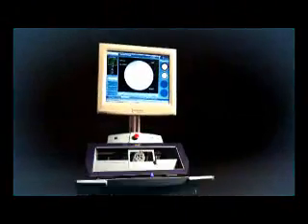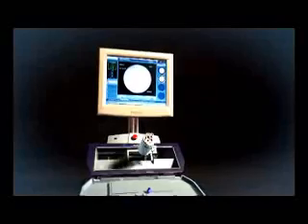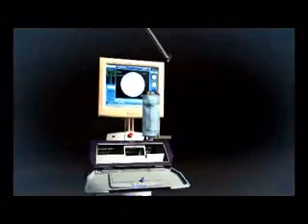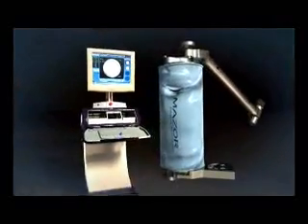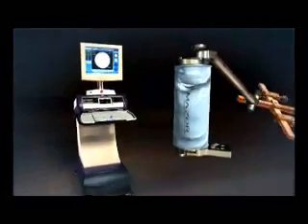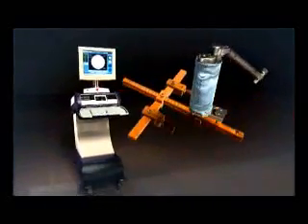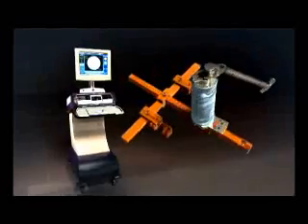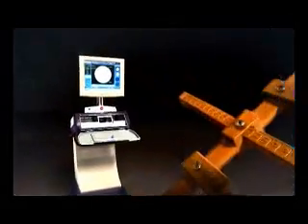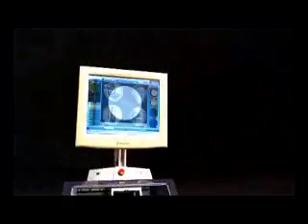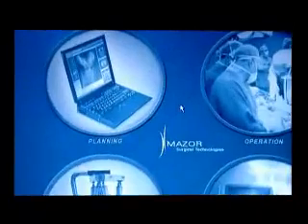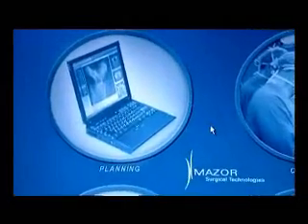The SpineAssist system is based on the SpineAssist device, utilizing miniature robotic technology, a disposable T-frame bar called Hover-T, and a workstation running advanced image processing software.